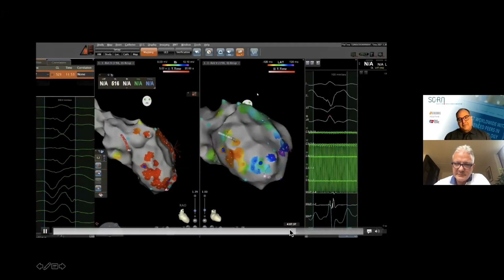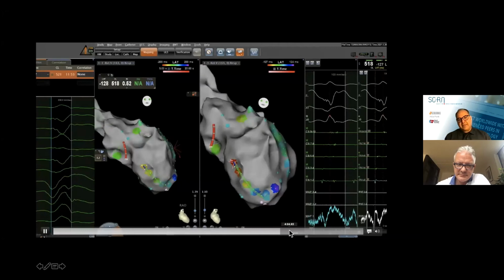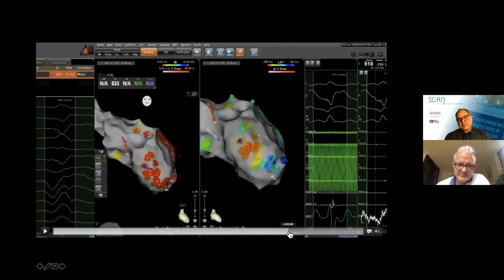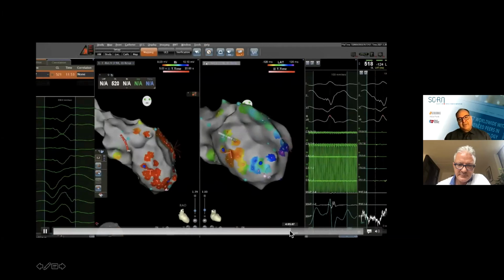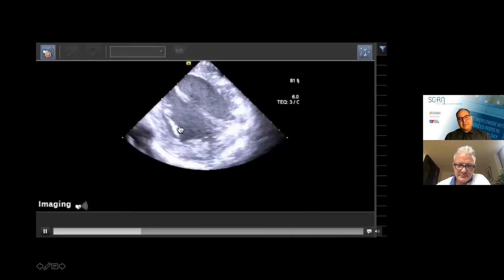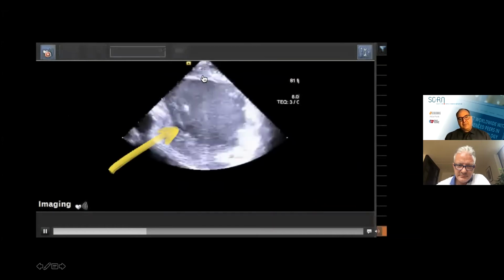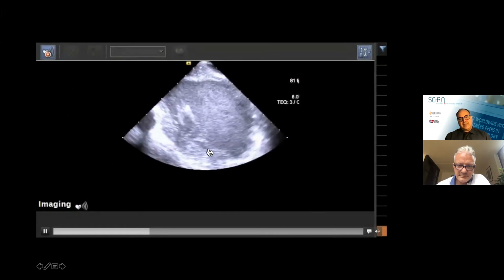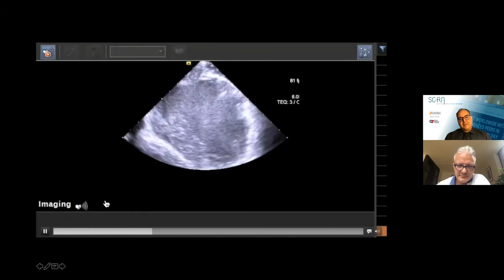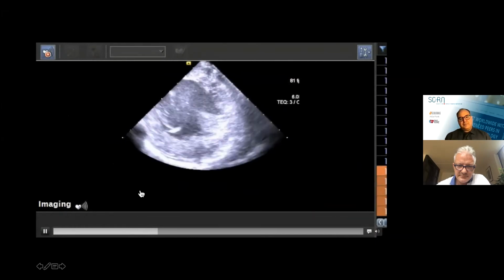Yeah, actually, I did. So if you go back here, when I pulled the decapolar catheter out and put the ablation catheter back in, which is right about here, if you look, I'm not ablating here. I'm actually mapping because there were some areas where I wasn't confident that the decapolar catheter had adequate contact. You can see it on the echo. So look at the bend of the catheter. There is no way that you can reach these areas with a decapolar catheter. Just give it 1 second till it comes out of the pap muscle. They're right there.